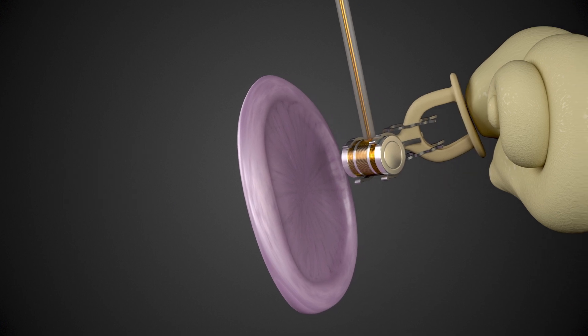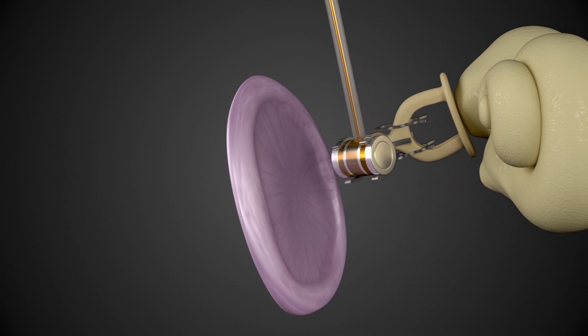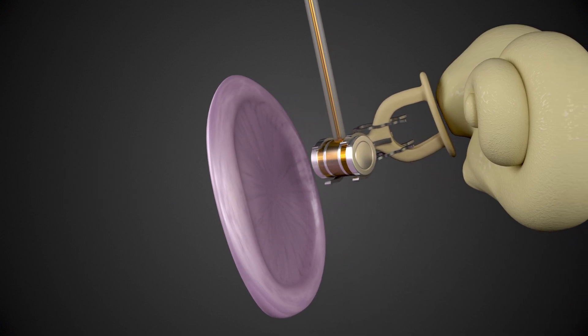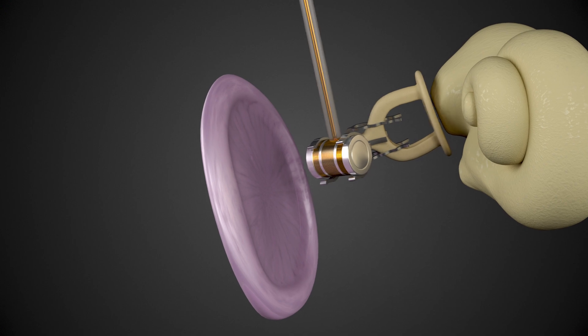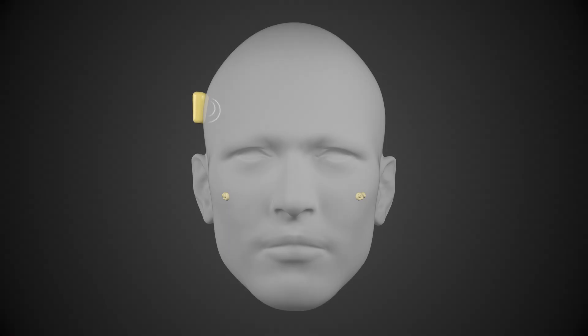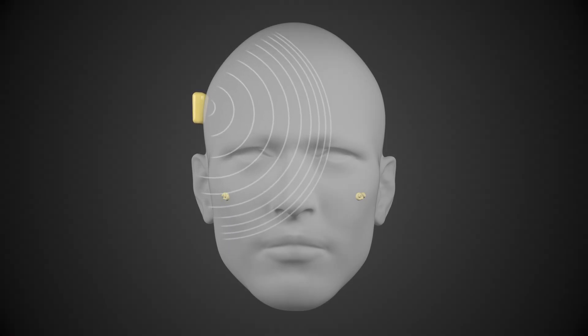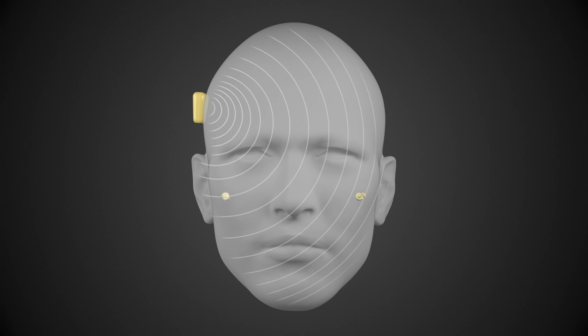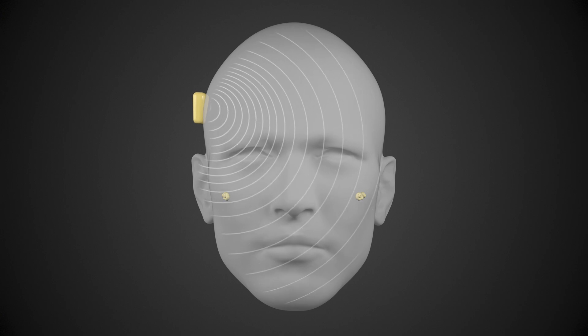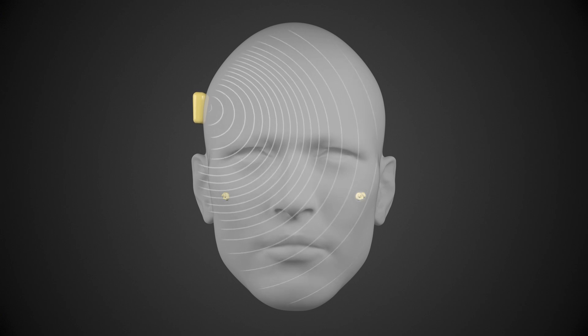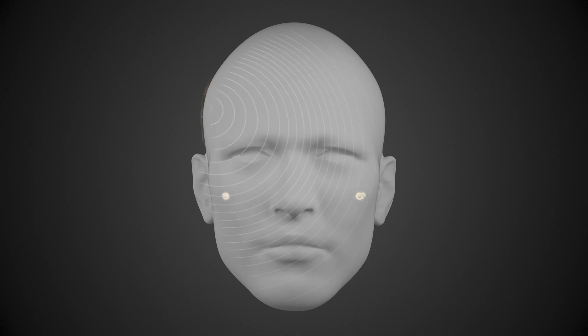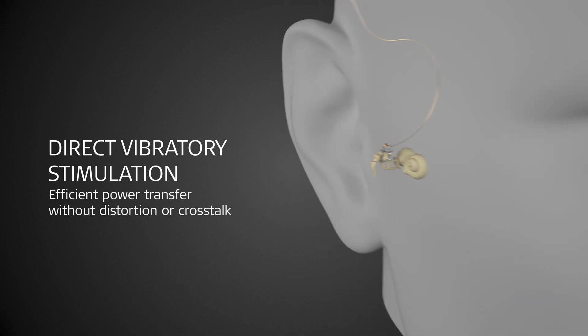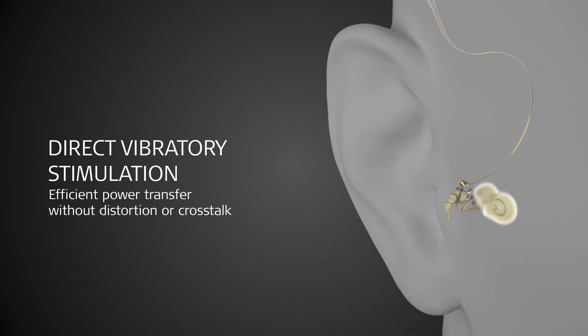Vibrant Soundbridge vibrates the ossicular chain directly. While bone conduction implants can generate feedback and crosstalk to the contralateral side above a certain level of vibration, Soundbridge exclusively stimulates the implanted middle ear.